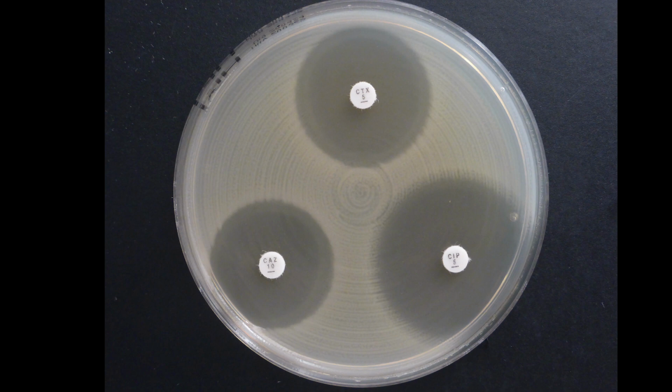Usually the main problem when reading zones for organism-agent combinations with fuzzy zone edges is that people read them too small because they look too closely. If you look at the second picture here, for example, you will look at each and every edge of this stripy pattern.